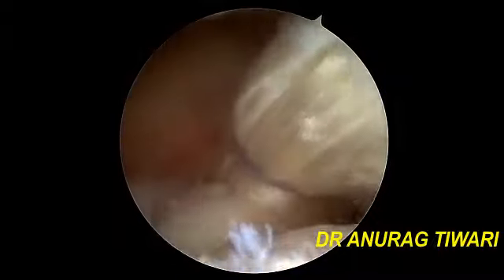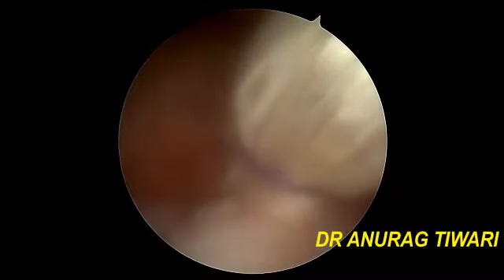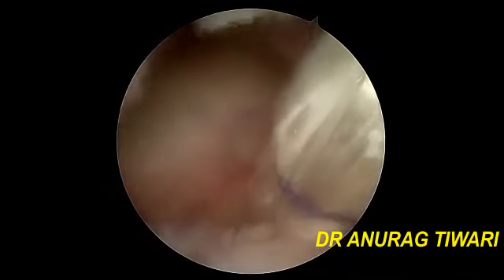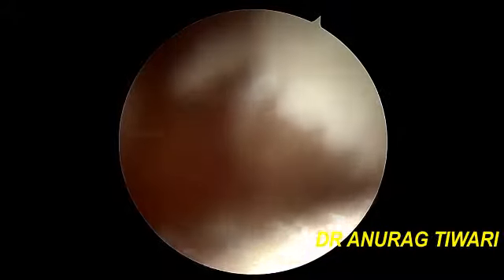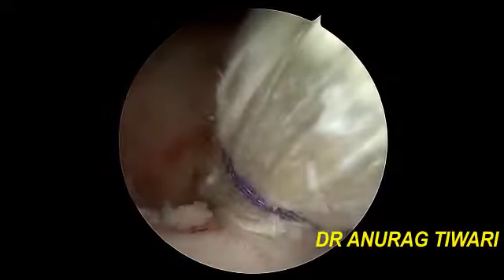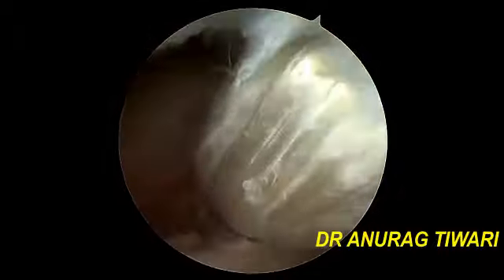There is a separate video on how to make a graft and how to harvest the peroneus longus. So through the adjustable threads we have now adjusted its length. The loop length can be adjusted, and that's why we have pulled the graft into the femoral side. So this confirms that adequate, around 18 to 20 mm, has been inside the femoral tunnel.